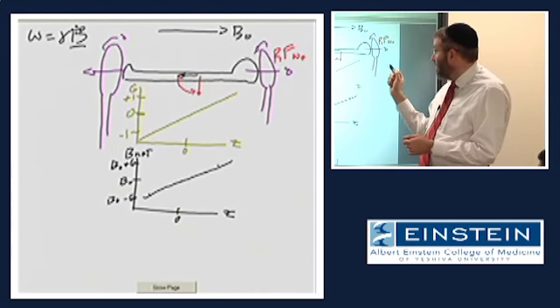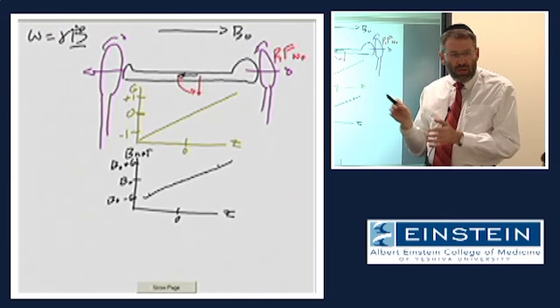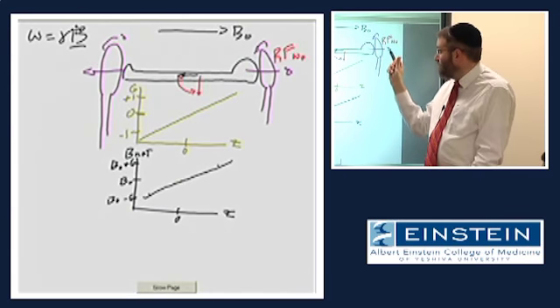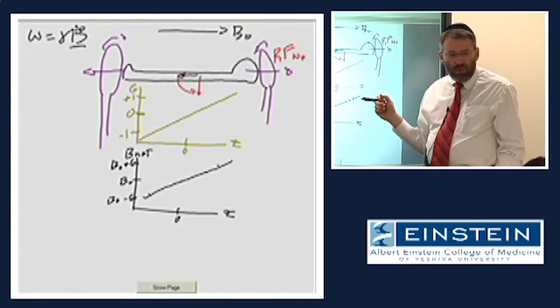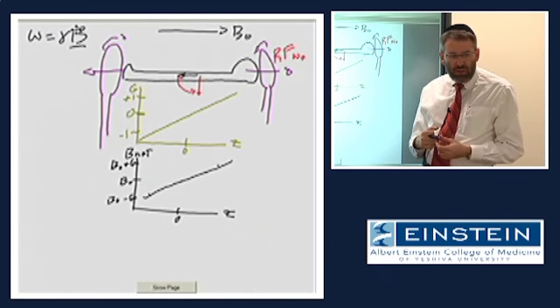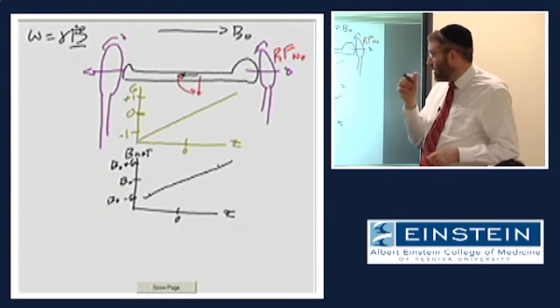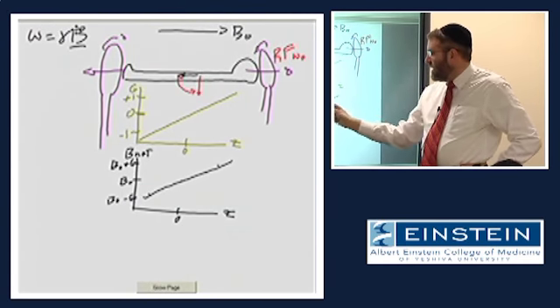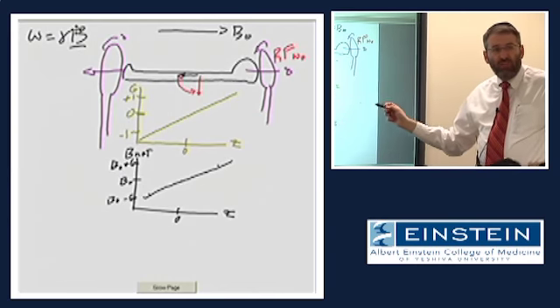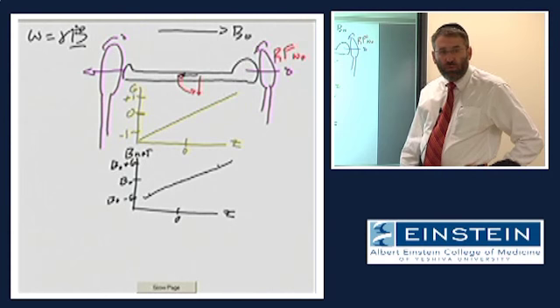Okay? Unlike the static magnetic field, which is always on and is perfectly homogeneous, these gradient magnetic fields are not always on. They're only on during imaging, and only during certain times when you're imaging. We're going to talk about that more tomorrow, or a little bit today. So this is the nature of the net magnetic field strength as we go up and down along the length of the bore of the magnet.